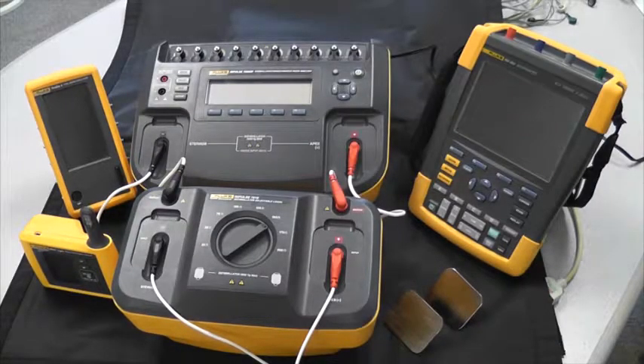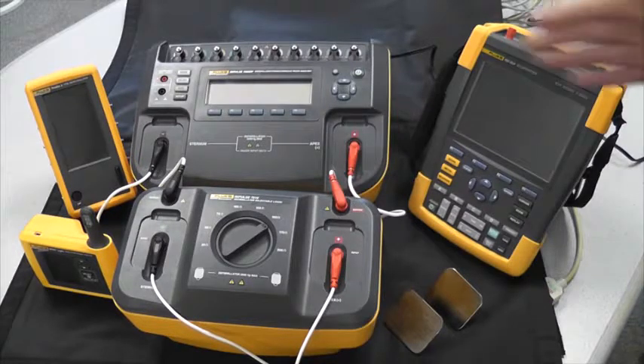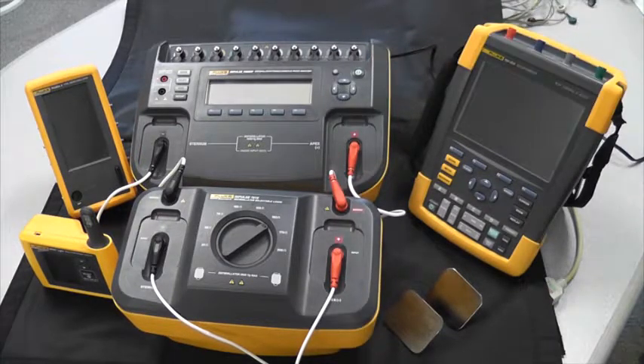Hi, we're here today to introduce you to the total product solution to test your defibrillator/pacer. The first product in this solution is the Impulse 7000, which tests the performance of defibrillators with integrated pacemakers.